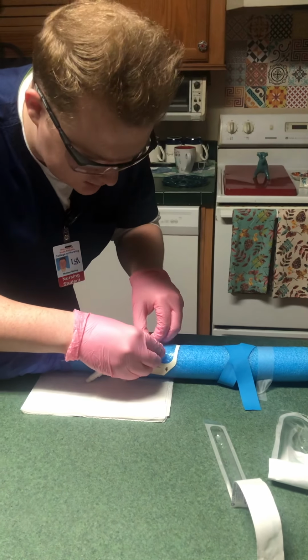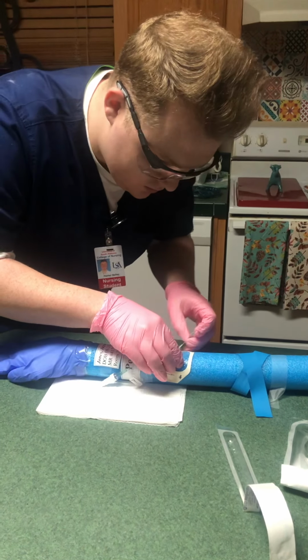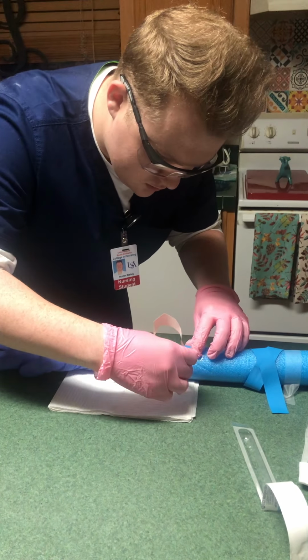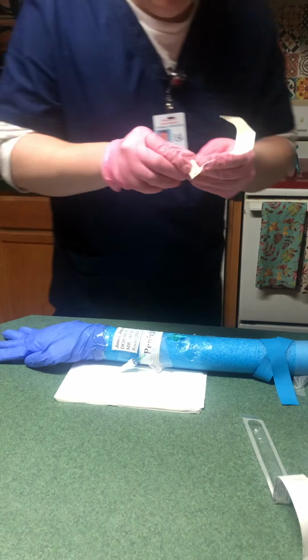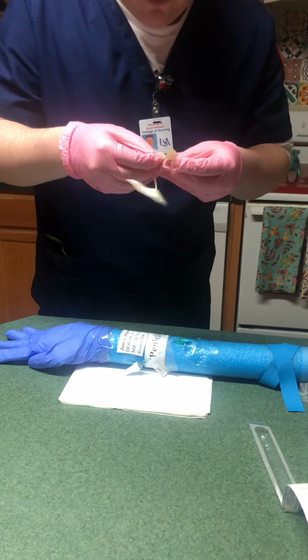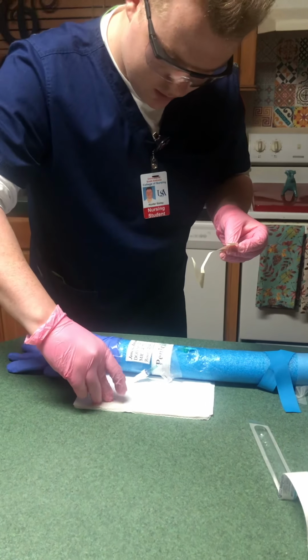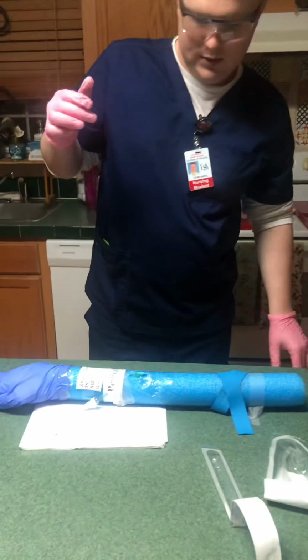Okay, once it's on, I can remove this, but I'm going to save this piece of tape right here for labeling. So I would just put it right there. I'm going to dispose of this in the trash.